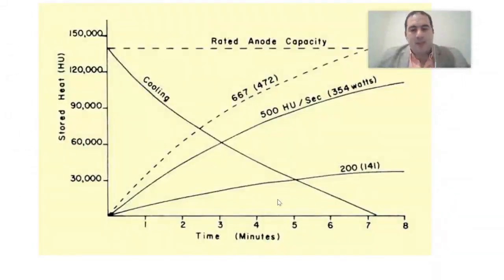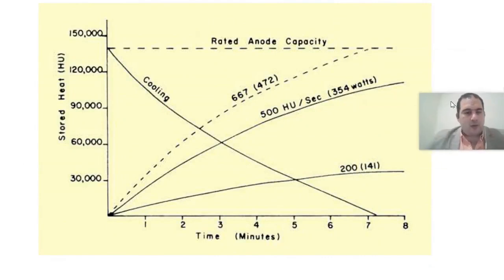Here we have the anode cooling chart. For example, if this happens, you can request it from the machine itself. The machine needs to reach zero. This zero area requires complete cooling. For instance, if I had a value that needs to reach this point, how long does it take to get to zero? From this curve, you can see that it takes about a certain time, which is approximately the time needed. So this cooling gives you an indication of the time the machine needs to reach the optimum state to provide a new exposure.